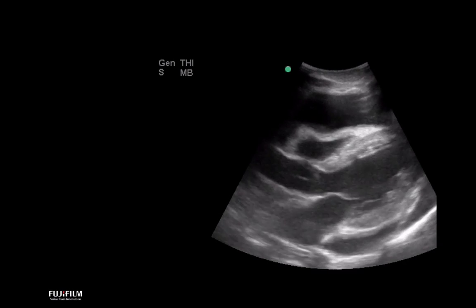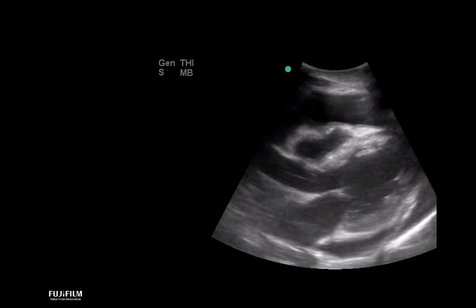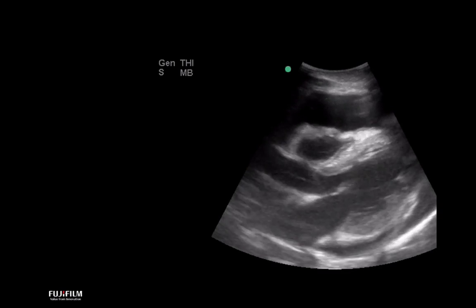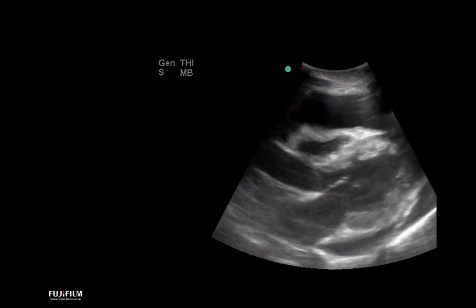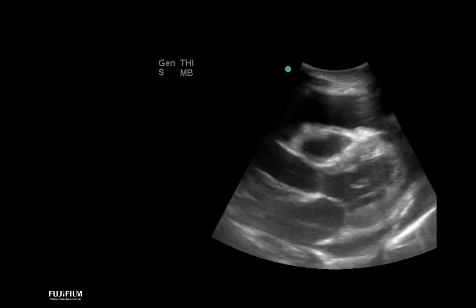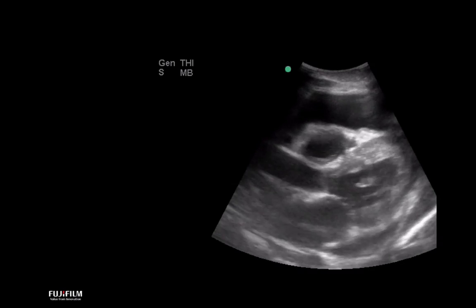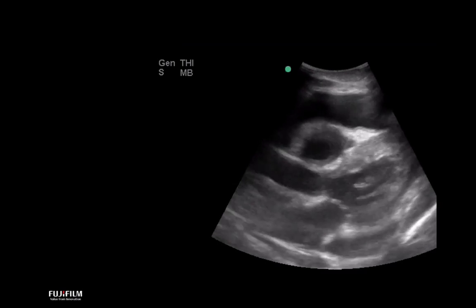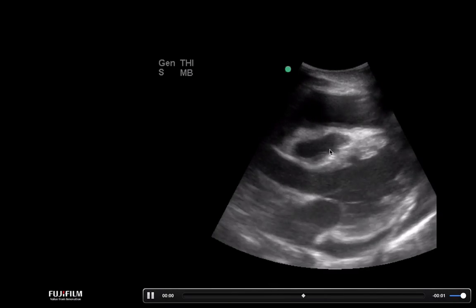This is a patient that I had that came in with hypotension and difficulty breathing. He actually had a uremic pericarditis, and you can see from this short clip, he's having signs of tamponade. He has a couple signs I'm not going to get into detail with, but clearly had clinical signs of tamponade, and actually his right ventricular free wall is collapsing in diastole. This is his right ventricle.